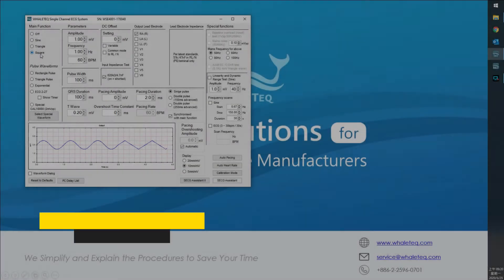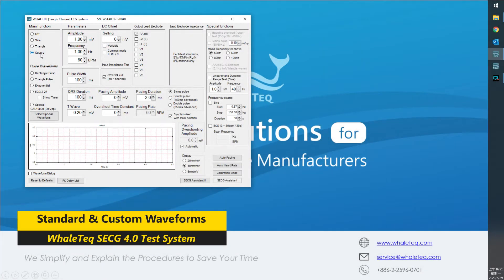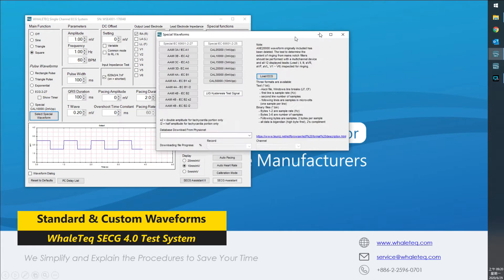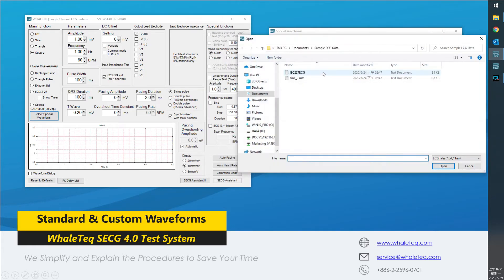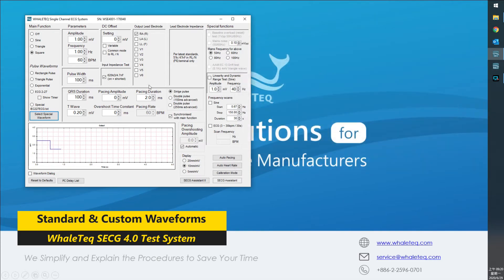SECG 4.0 can not only play the standard waveforms, but also your own ECG data file, letting you replay clinical trial data and recreate special test cases easily.